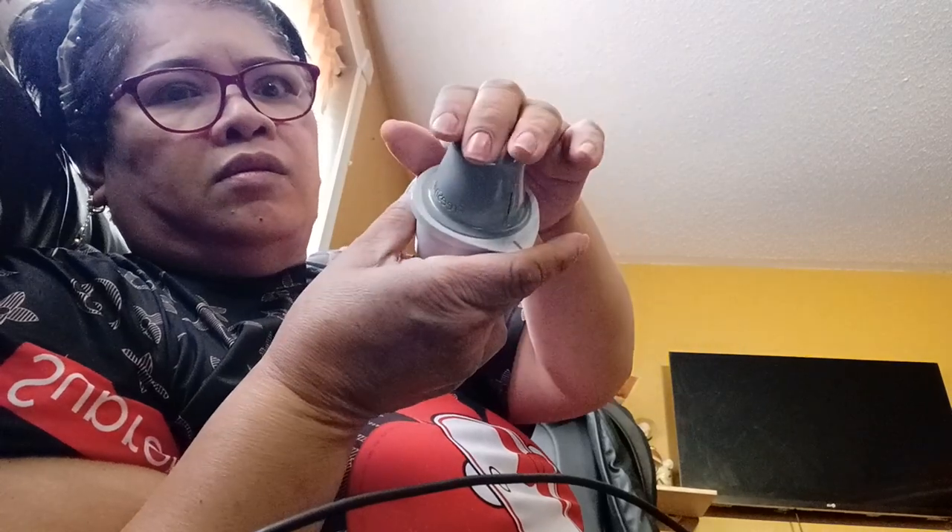Then you just pop it and apply the alcohol to your shoulder here in a circular motion. One more circular motion. And then you're ready to use it — right here on top.